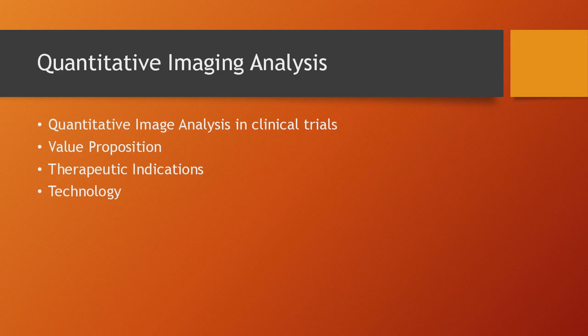Regarding other indications, for example, we are working with steatohepatitis in liver, and this is very important because recently, in a quite important paper, we have demonstrated that steatohepatitis is related to the coexistence of not only fat, but iron in the liver tissue. So we have developed a method to simultaneously quantify iron and fat concentrations in liver, and it's having a great success because it's acting as a prognostic indicator of fibrosis and later cirrhosis in liver. And we are working therefore in the quantification of these fat and iron deposits.